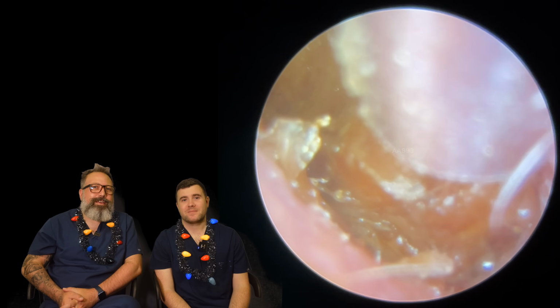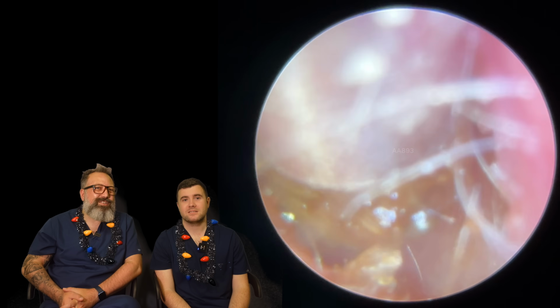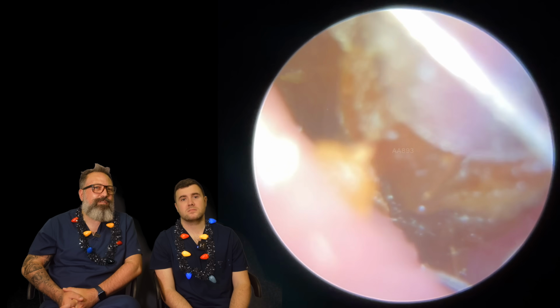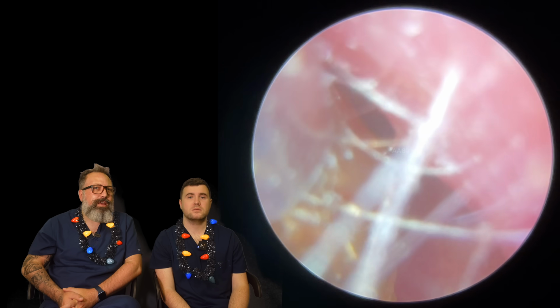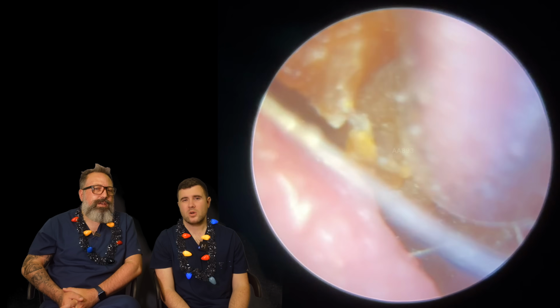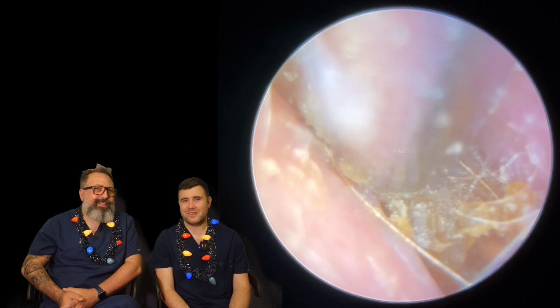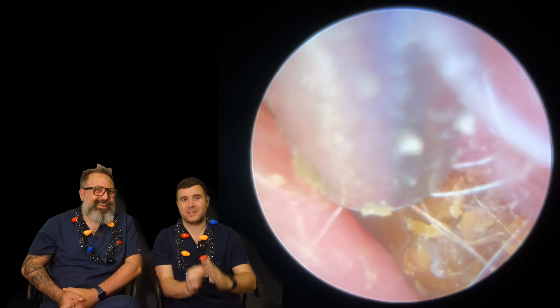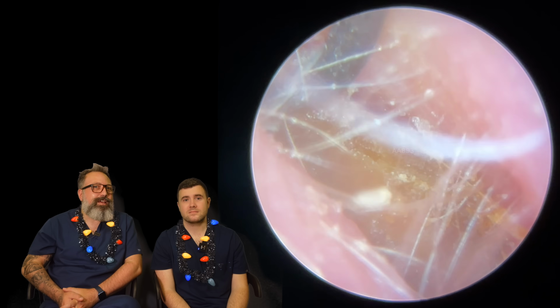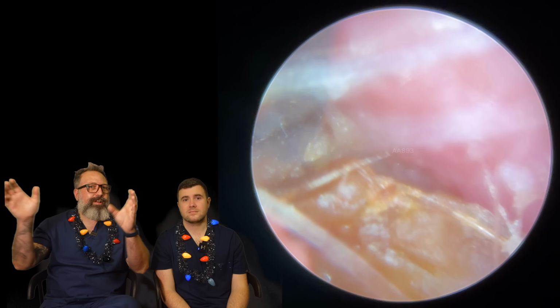So it's coming away. This is quite hard. Now this patient does come through on a regular basis, probably about every 12 months, to get their ears cleaned out. They are a hearing aid patient as well, so they have got some hearing aids from us. Oh, I was just going to say, you can kind of see the sides trying to suction into that tube there. You've got to be really careful when that starts to happen, because you are more likely to get the whole thing collapsing around the side.